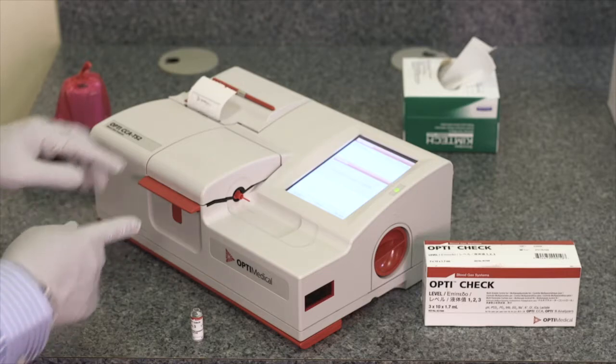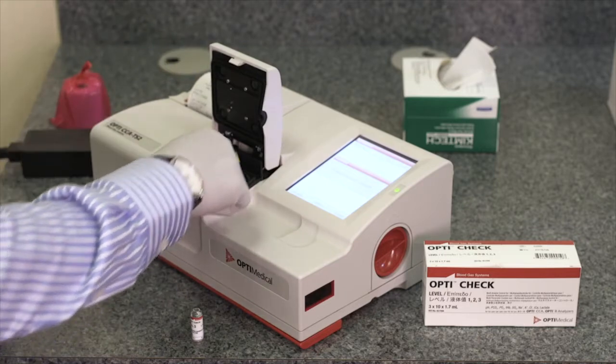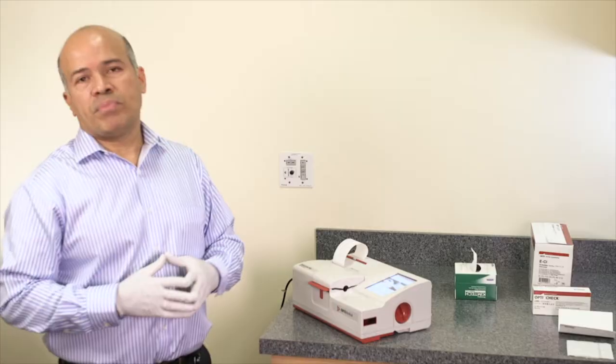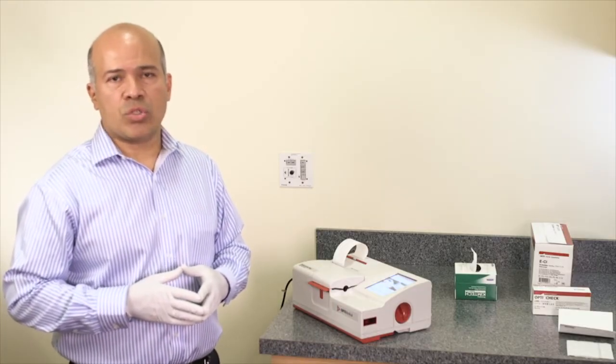To remove the cassette, open the cassette cover, remove the cassette, and dispose of it according to regulations. This completes the quality control of the OptiCCA-TS2 analyzer.